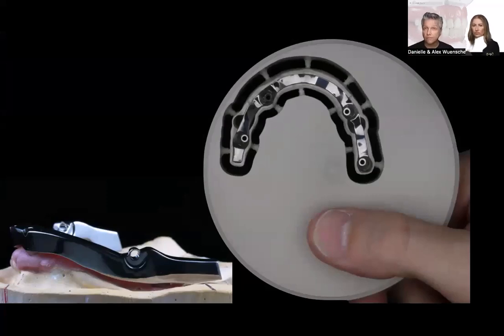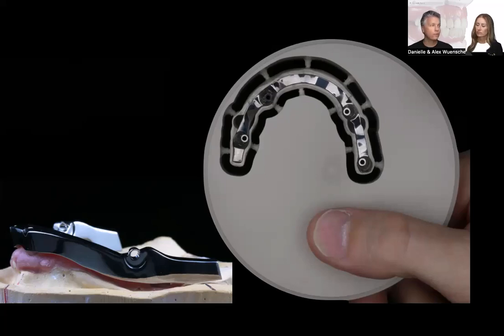frame out of Pecton. It's a high-performance polymer. Again, I'm not able to tell you what's better or worse. All these materials work very well. We have very good success with all different materials. What we utilize for our secondary frames is more like a preference. Yes, there are borderline cases where it's very, very thin, where the vertical dimensions may be challenged. I would rather go with metal at that point. But in general, we can utilize high-performance polymers, speak Pecton, SLM, speak chrome cobalt, metal printed basically, or a titanium milled bar. They all work, right? So they're all pretty good.